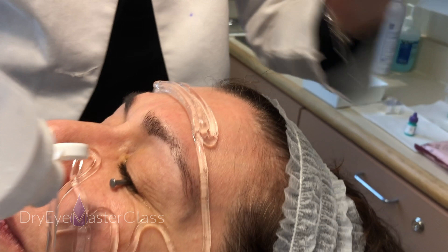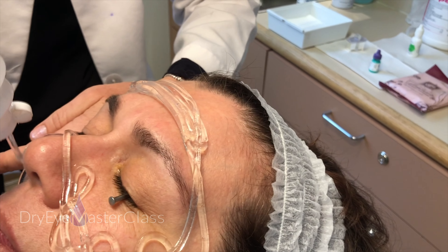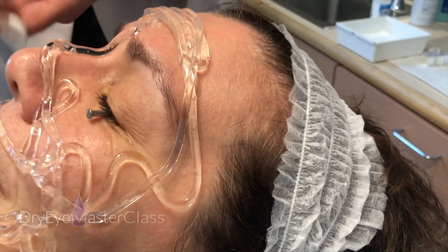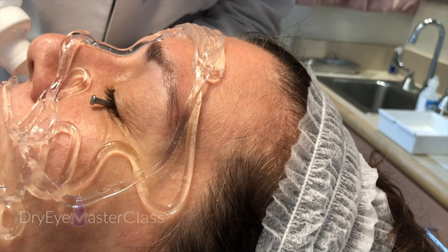A nice generous application of the ultrasound gel is important — don't skimp on this, because this is how the light energy transfers in a uniform manner to the skin. I'm fairly generous with it and I do a generous application, almost like frosting a cake.